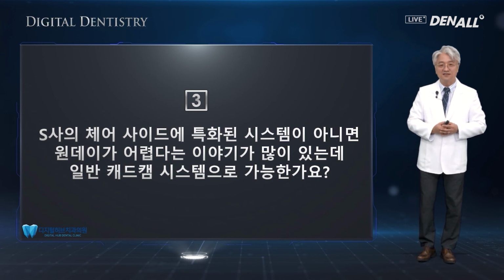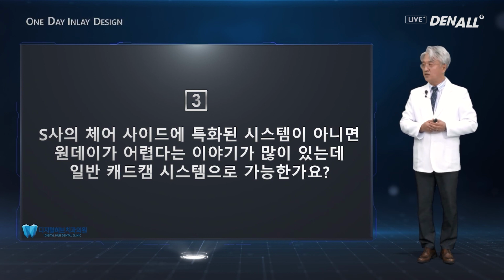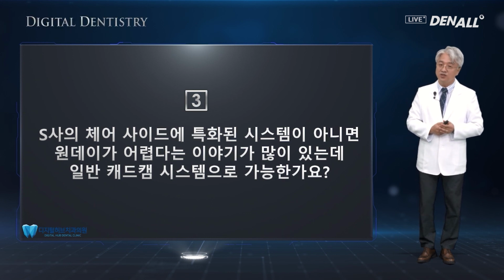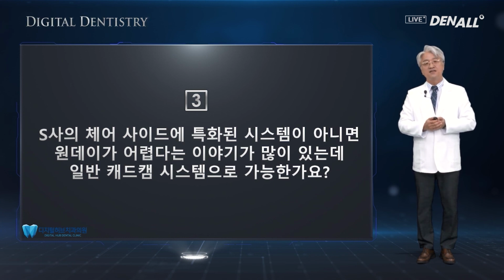Now, I believe this person studied a lot about CAD-CAM system. Yes, it was so up to now. I think I know which companies you are referring to, but their CAD-CAM system has been customized for the one-day approach. This is because milling and design time is very short with this system, so one day was possible.